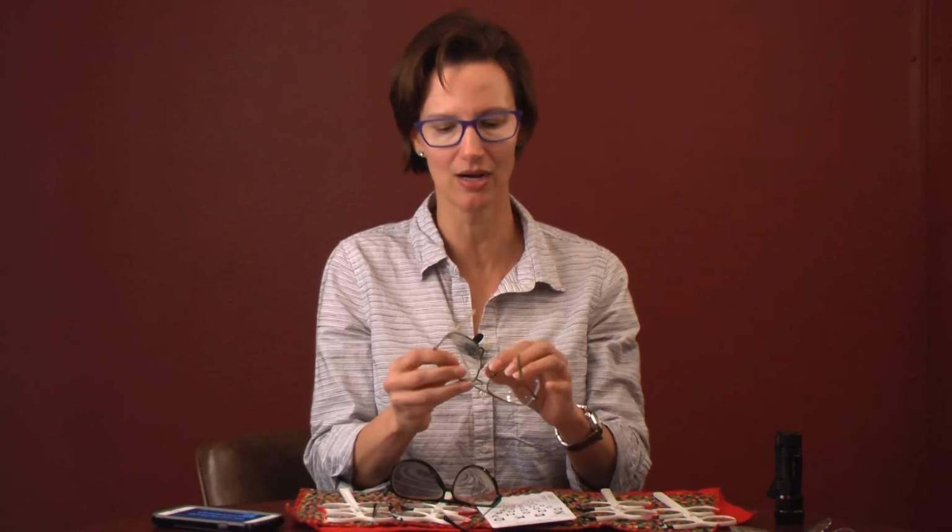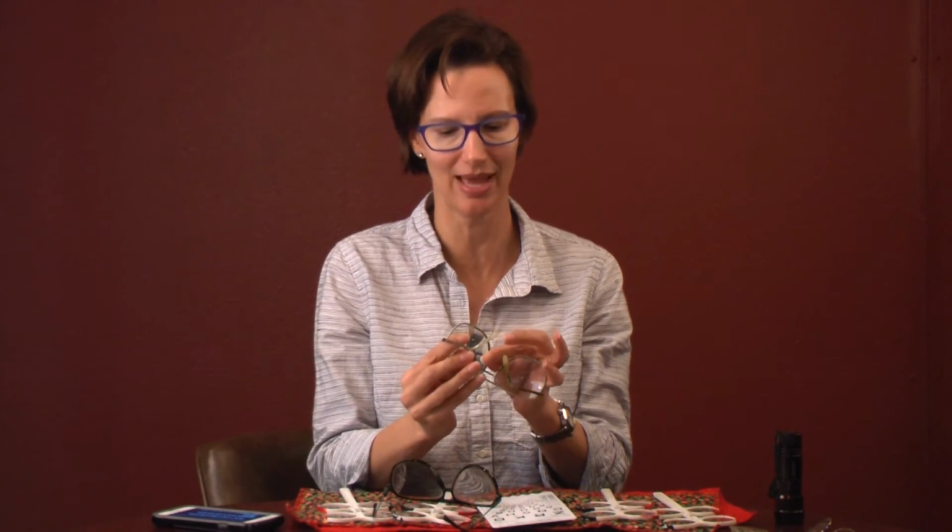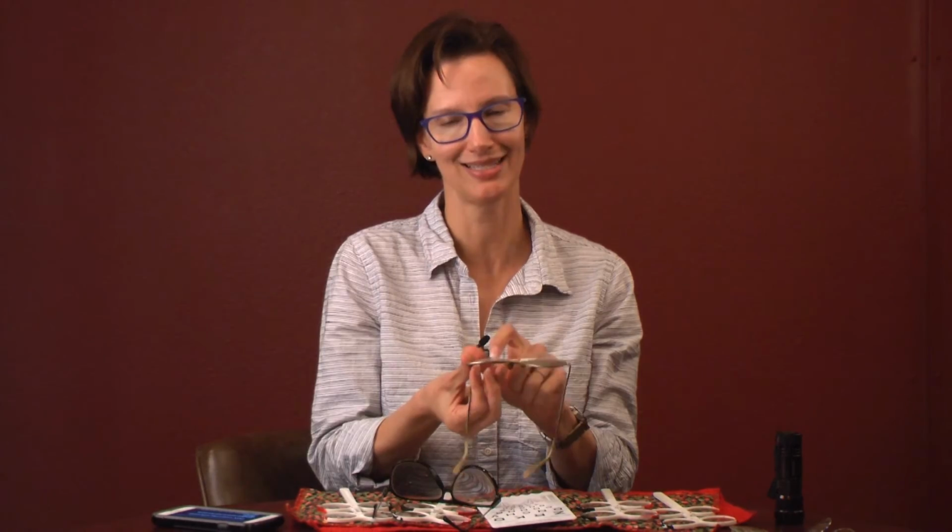You want to secondly look at the nose pads. These are disgusting, and they are in terrible shape. A lot of times they'll be missing. Don't dispense a pair of glasses without nose pads, because that would be uncomfortable, and you wouldn't wear something without nose pads. I wouldn't take anything like this, honestly, on my trips, because these are in such bad shape. They're super, super worn down, and the glasses are really scratched.